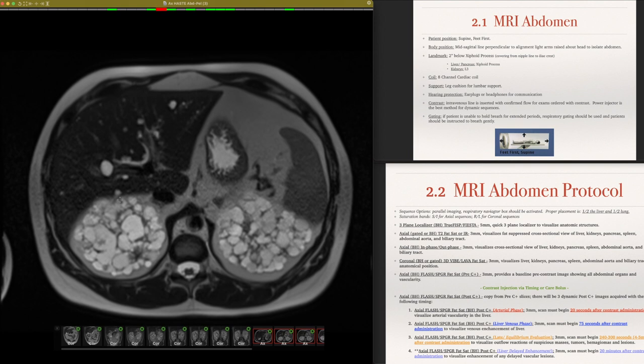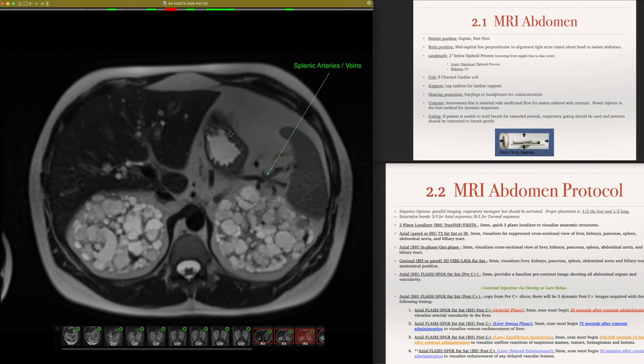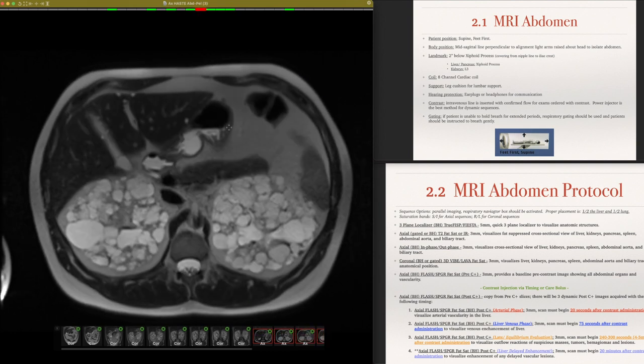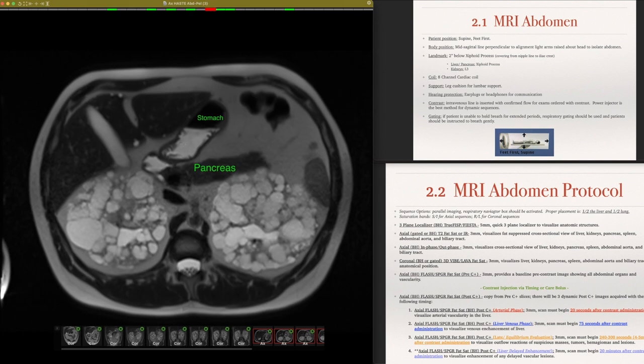So again, right kidney, left kidney, okay, stomach. Remember how I said it was pretty much in cross section because the stomach in this position was going from anterior to posterior. So now we're able to cut it from the top and see the stomach from a different view. The other thing I noticed was when a patient's recumbent, any food or gastric fluids are going to create this line of air versus fluid because they're lying flat. So think of putting a cup on a table. There's going to be air above and fluid below. So kind of neat to show that and outline that.